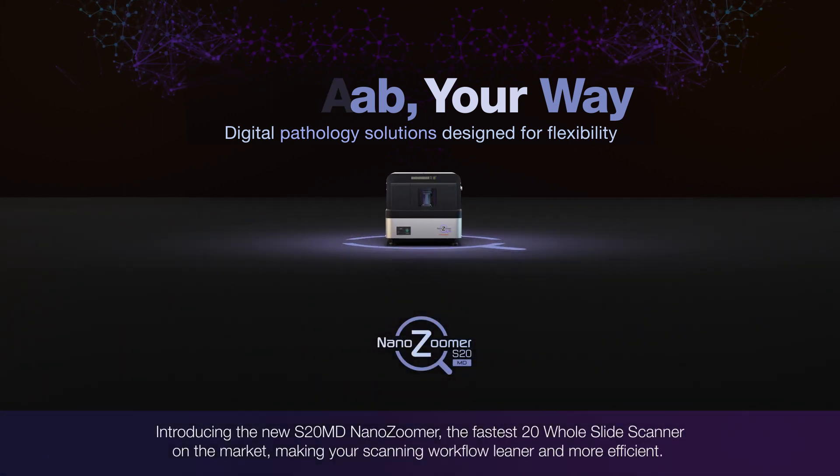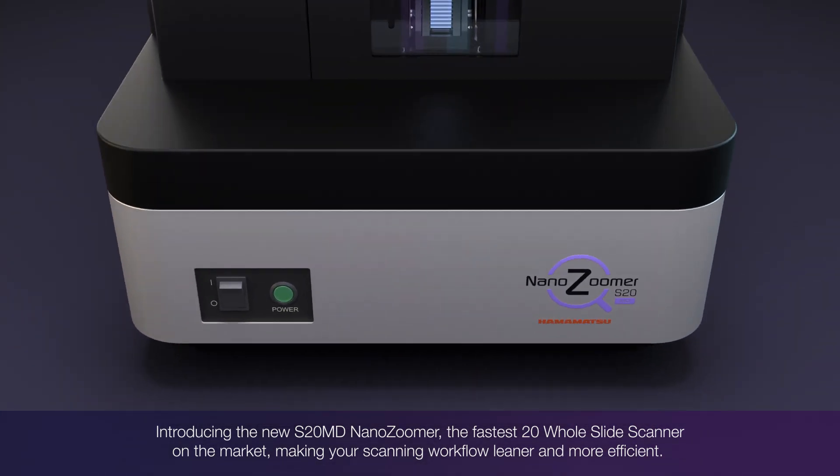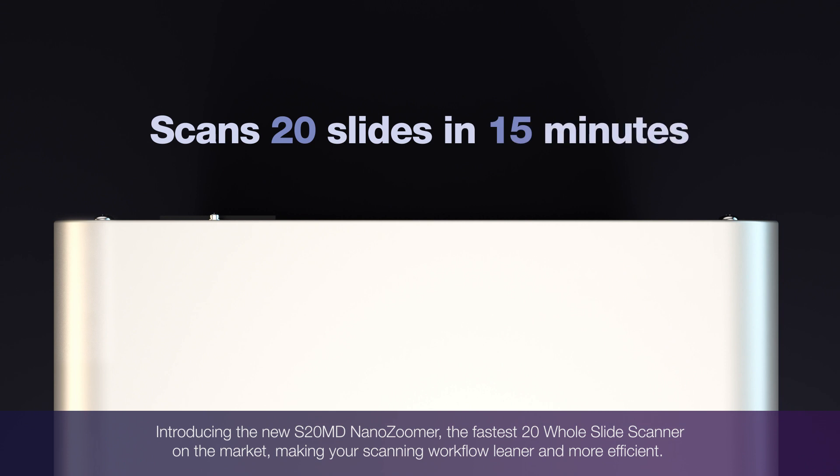Introducing the new S20 NanoZoomer, the fastest 20-slide scanner on the market, making your scanning workflow leaner and more efficient.